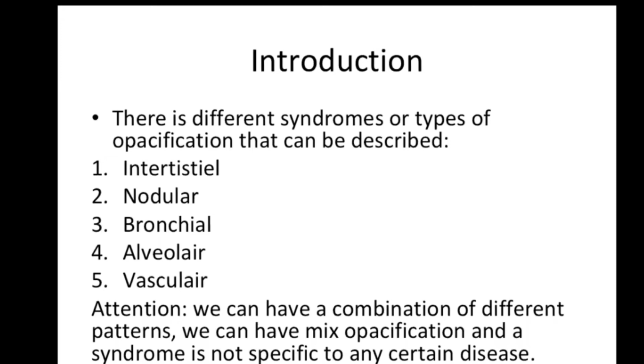How do we see interstitial pattern? How do we know it's a nodular pattern? What are the causes of bronchial pattern? We will talk about it today. So these 5 words are very important.